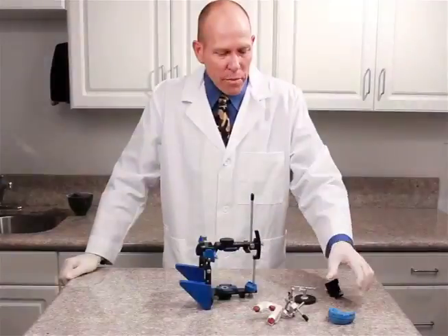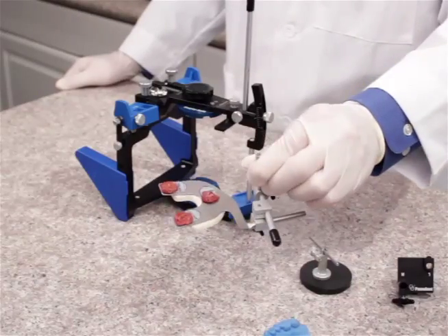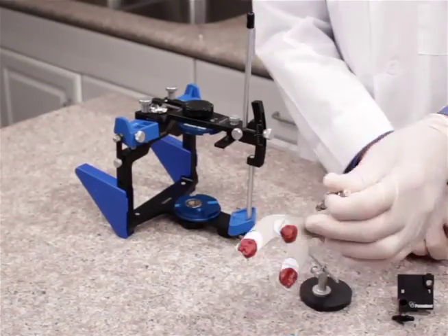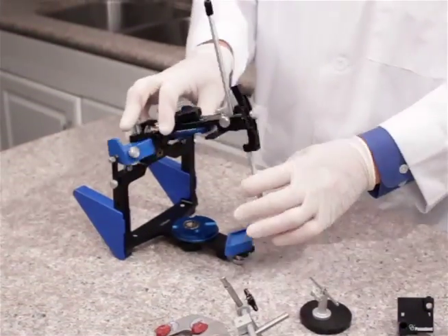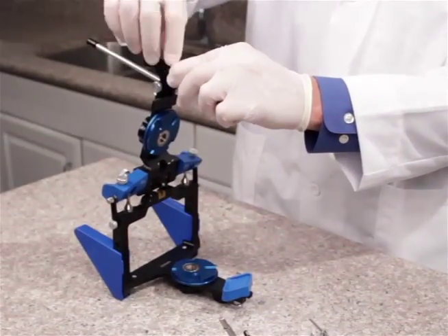We're now in the laboratory getting ready to mount our maxillary cast using our bifork assembly from the Panadent. In preparation for that, we do want to remove the bifork stabilizer from the bottom of the bifork. We also want to set our incisal pin at zero, so I'm going to adjust this to the zero mark and tighten it in place.